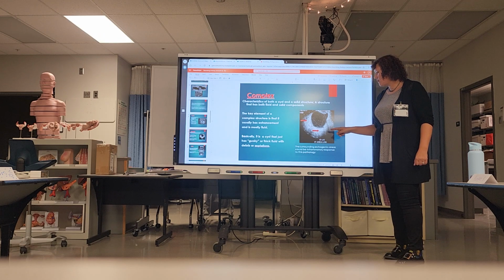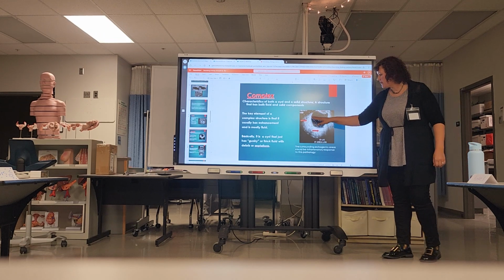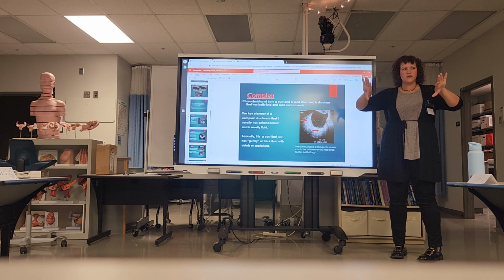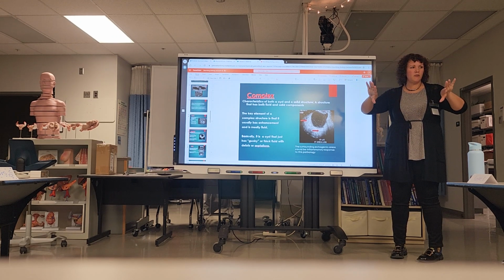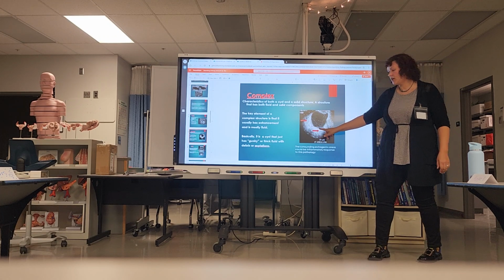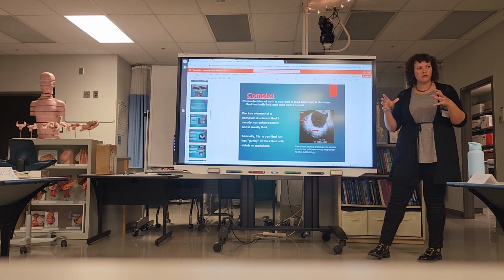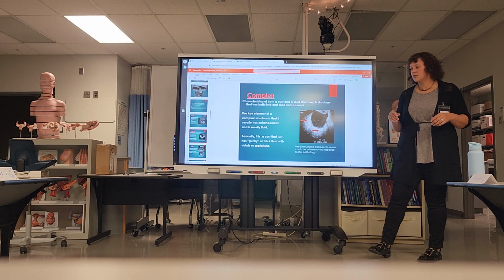So that is something that you have to be aware of. If something is infected, it's also going to affect the tissues around it, and that can become an inflammatory response and just make everything around it echogenic. But it won't be this echogenic. Like, this is really echogenic. So with the inflammation, you'll still be able to make out the structures. It'll just be a little bit brighter than usual.